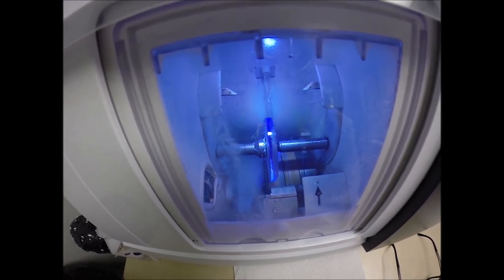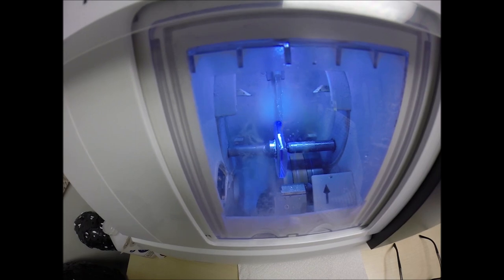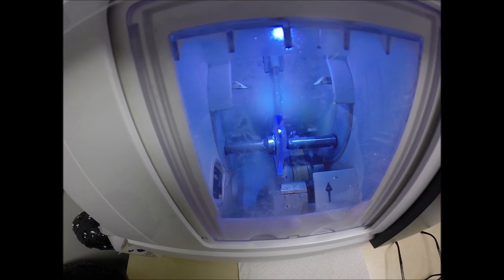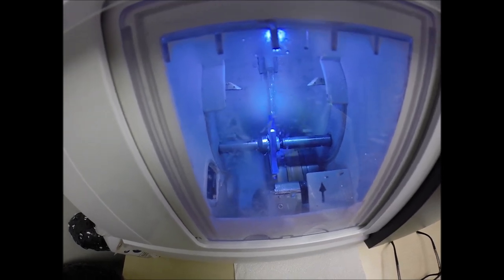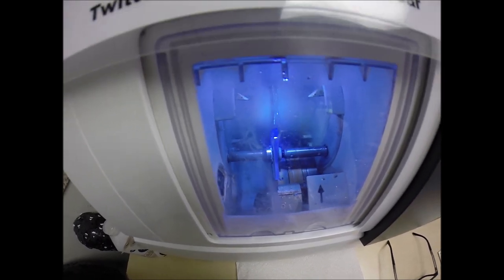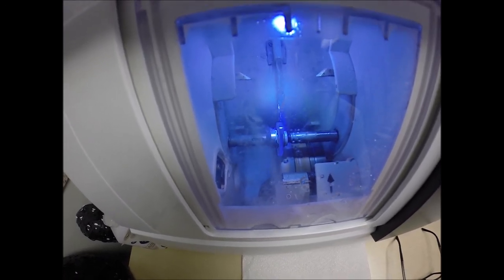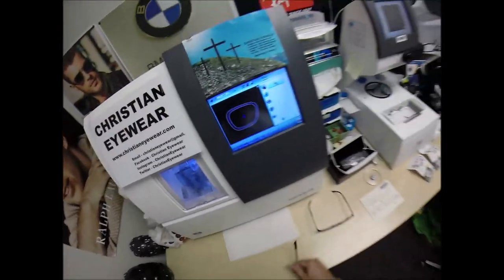Water is spraying onto the lens — that's something you normally don't see in my videos with polycarbonate, but high index plastic and Trivex cut wet, meaning that water sprays onto the lens for the duration of the cutting cycle. You do have 100% UVA and UVB protection built into the lens. We know what the sun's harmful ultraviolet rays can do to your skin, where your eyes are eight times more sensitive than your skin. You have permanent sunscreen for your eyes, unlike lotions, creams, and sprays that you have to reapply every couple of hours. Zeiss has partnered with the American Cancer Society because they offer the most complete UV protection of any lab — their protection goes all the way up to 400 nanometers, while most companies stop at 380.